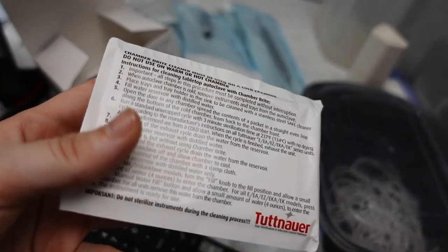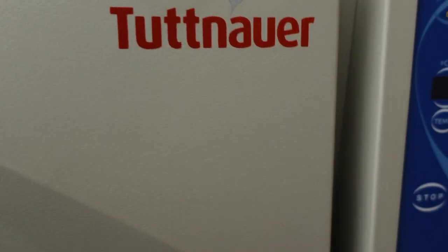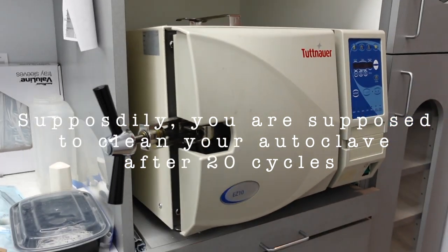This is what you use to clean the autoclave, or probably specifically the Tuttnauer, which is what we have. Supposedly, you're supposed to clean your autoclave after 20 cycles.